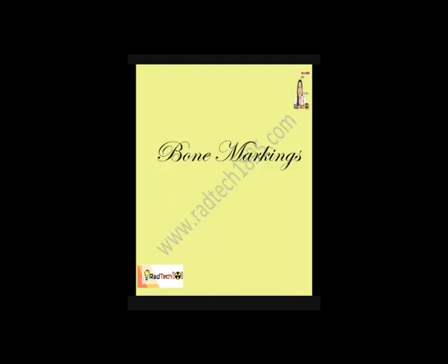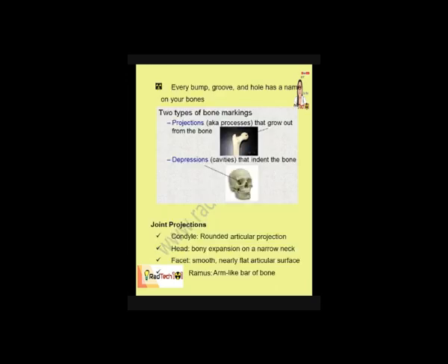Ay, wala akong picture. Teka. Wala yata. Kalimutan ko maglagay. Basta tandaan, kapag ang radiograph ay either paa or kamay, so kapag kamay, dapat nasa taas yung mga digits niya, yung kanyang mga daliri. Kapag naman paa ang tinitingnan natin, dapat nasa baba yung part ng paa. Yung toes niya, yung digits niya, yung femur, yung tibia, fibula. So, yan.